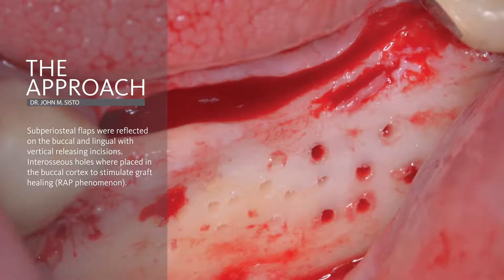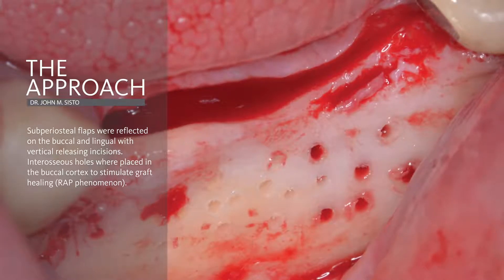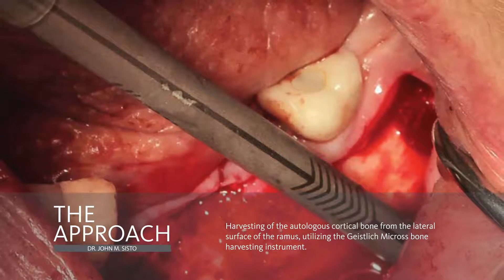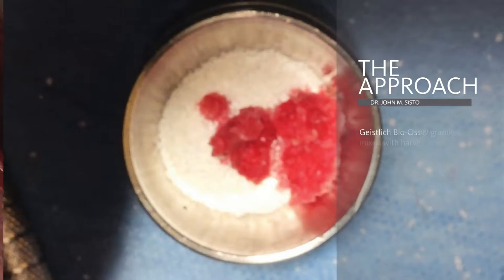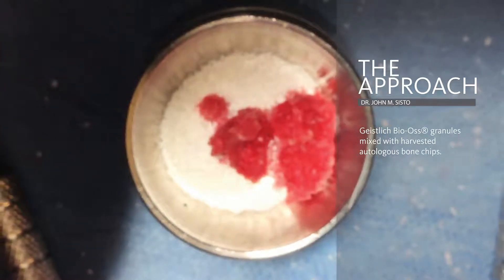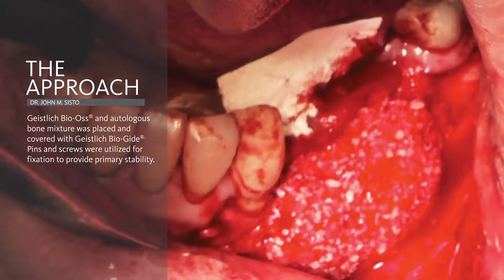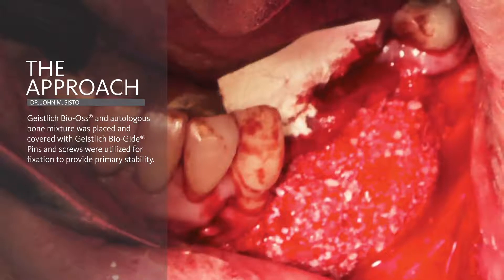The subperiosteal dissection was carried out onto the lateral ramus for harvesting autogenous bone, utilizing the Geistlich Micross Bone Scraper. The harvested autogenous bone is then mixed with Geistlich Small Particle Size BioOss. This anorganic bovine bone mineral provides a low substitution rate and long-term graft maintenance. This next slide shows the graft mixture nicely in place, adding significant horizontal augmentation to the site.